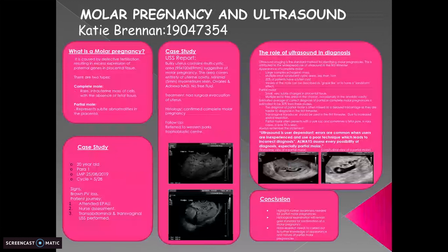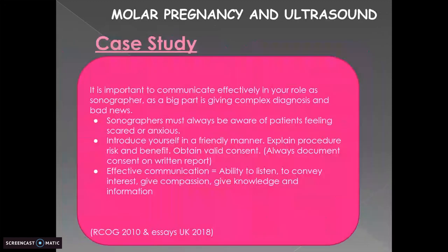The NICE Guidelines 2019 state all women should have access to an early pregnancy assessment unit 7 days a week. The patient is first assessed by the nurse, who then gives the relevant information to the sonographer. The sonographer should use effective communication to gain rapport and give an explanation of the procedure, the risks and benefits, in order to gain valid consent. This should be done in a timely and appropriate manner. The women should be cared for with respect, dignity, ensuring adequate privacy, as per the BMUS and the Royal College of Gynecologists guidelines.